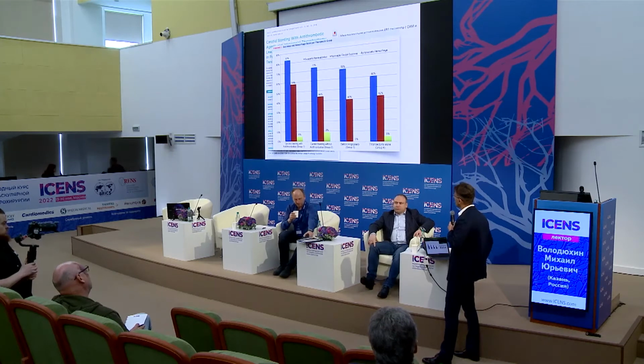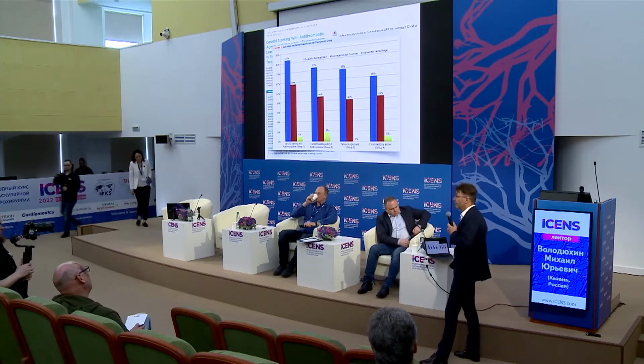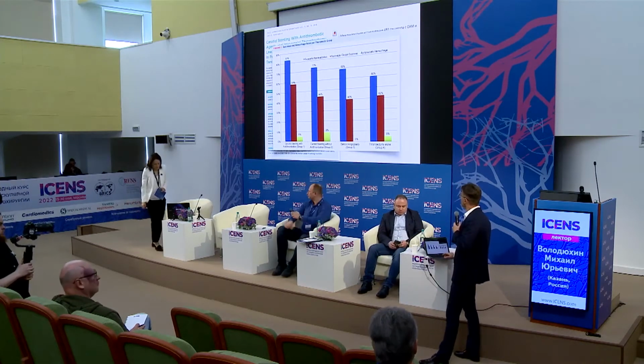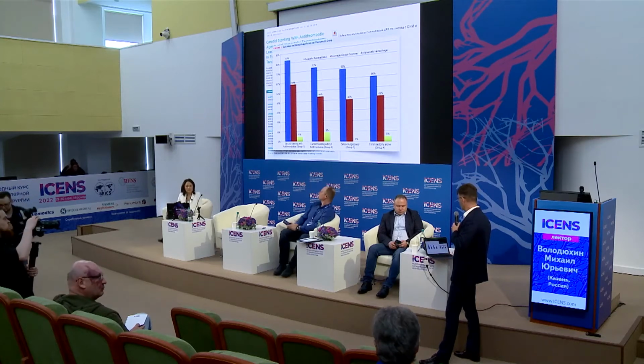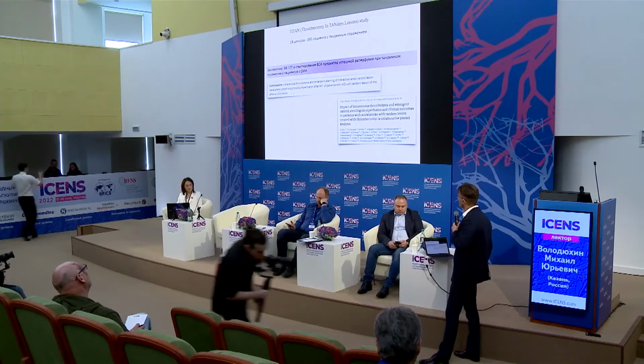Here are the results of a 2018 paper where a comparison of several revascularization techniques was done: stenting, balloon angioplasty, and others. It was proven that disaggregant stenting gives the best performance in terms of revascularization and functional outcome. Titan gave the same outcome, that patients after stenting had the best functional outcome.